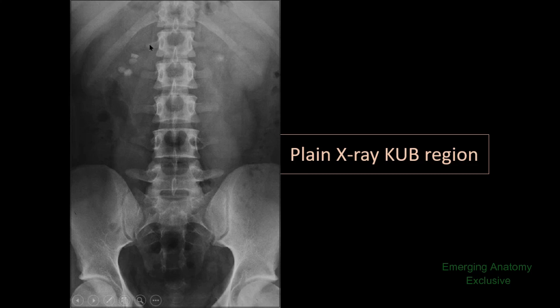On each side of the vertebrae, there are two lateral projections. These are the transverse processes. Here is one transverse process, here is another one. Here are the transverse processes — and here, and here also are the transverse processes.